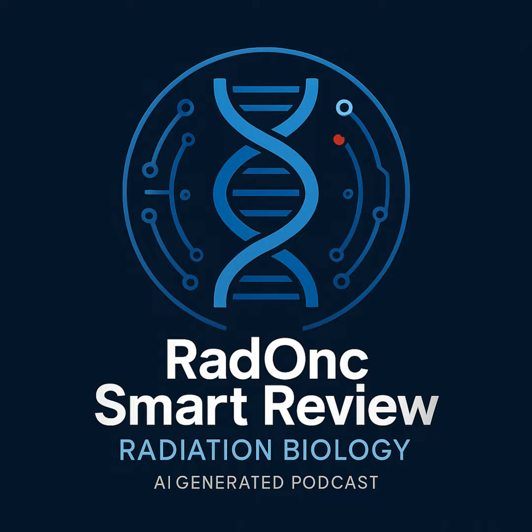And of course, the way we use these clinically now, you almost never see a PET scan done alone. It's almost always a combined PET/CT scan. Yeah, those integrated scanners are standard. And that fusion is where the magic really happens for us in radiation oncology, isn't it? Absolutely. You get the CT scan, which gives you that beautiful, sharp anatomical detail. Your roadmap shows you the bones, the organs, the exact shapes and locations. And then layered right on top of that, you get the PET scan information. The functional data, where the glucose metabolism is high, or where the hypoxia is, or proliferation.